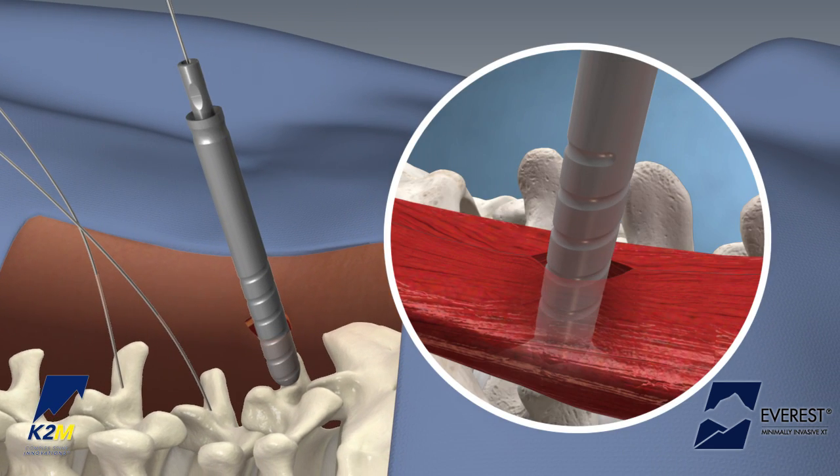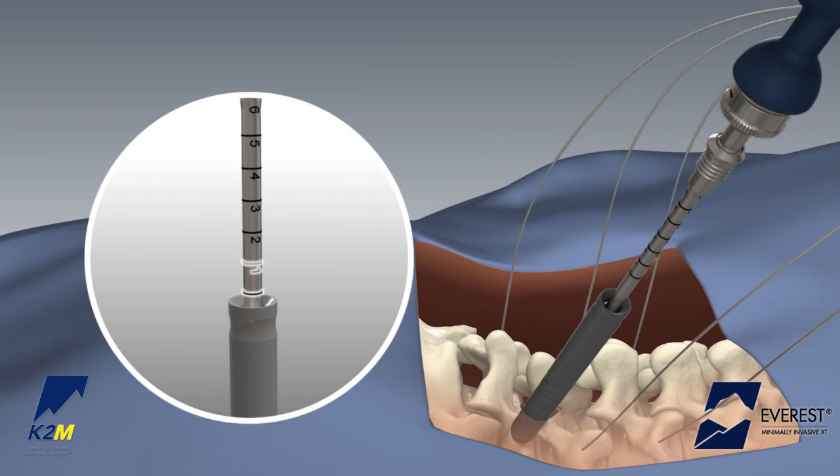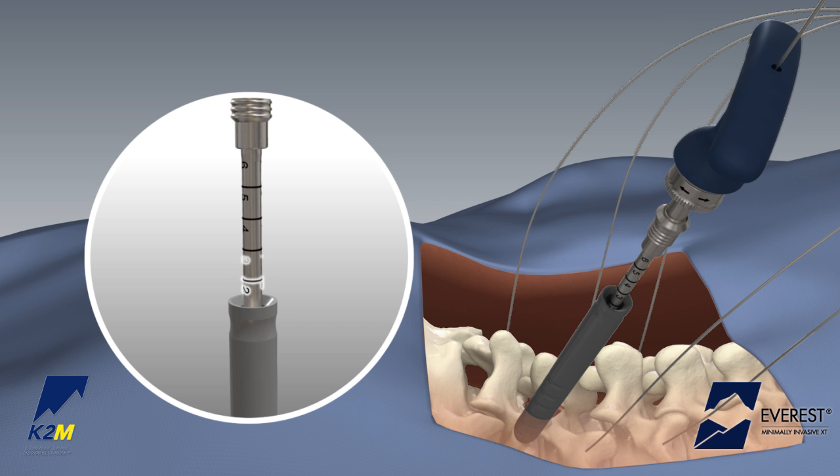This is followed by the outer dilator. Prepare the pedicle for screw insertion by advancing the all-tap over the guide wire and into the vertebral body. External markings on the tap provide a reference for how far the tap has advanced into the bone.